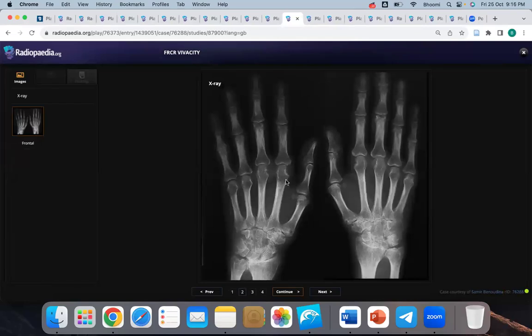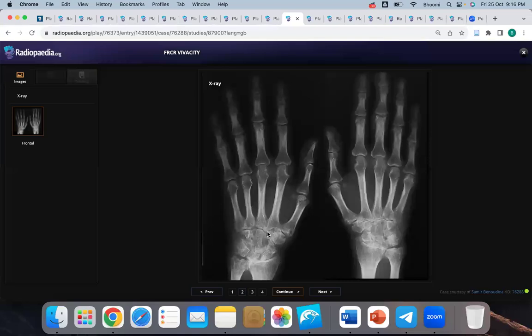This is a hand radiograph of an adult patient. There is bilateral symmetrical arthropathy at the metacarpophalangeal joints with juxta-articular erosions. There is also involvement of the wrist joints and carpometacarpal joints, with periarticular osteopenia and sparing of the distal interphalangeal joints. I am most concerned about rheumatoid arthritis. I will correlate with rheumatoid factor levels and refer to rheumatology for further management.